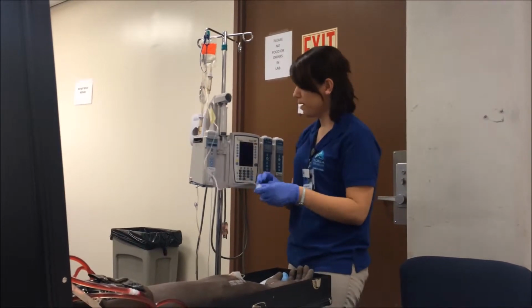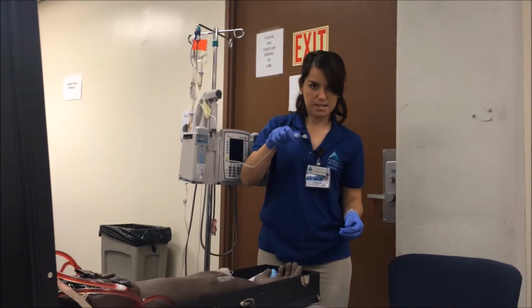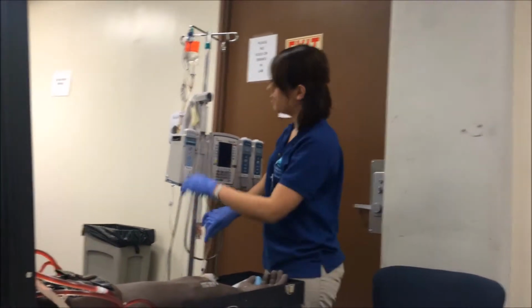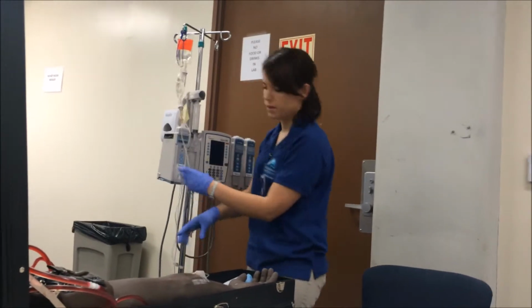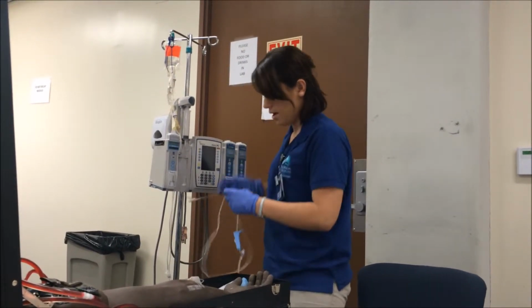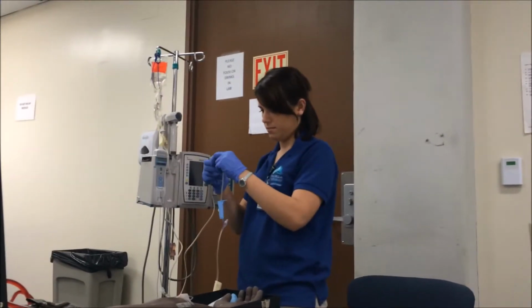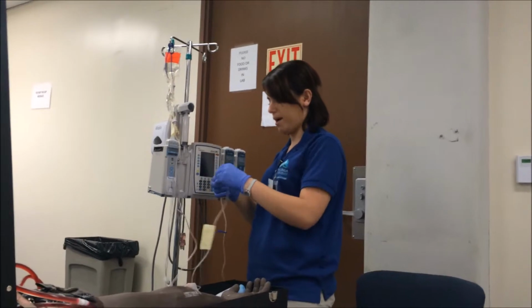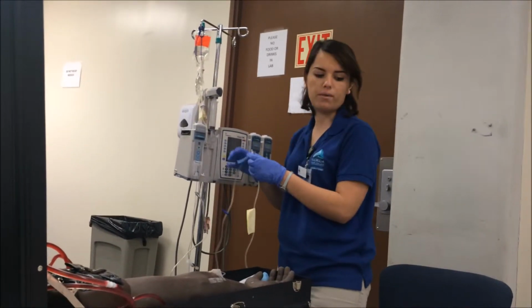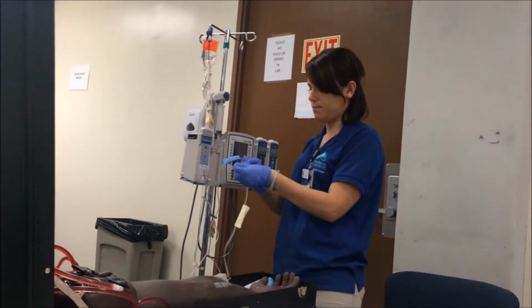So I'll go right ahead and prime my piggyback, and that is primed. Right back up. Okay, so at this time, I'm gonna go ahead and unclamp everything from my primary, so I can let my piggyback run. Okay, and I will go right ahead and attach my piggyback to my primary.